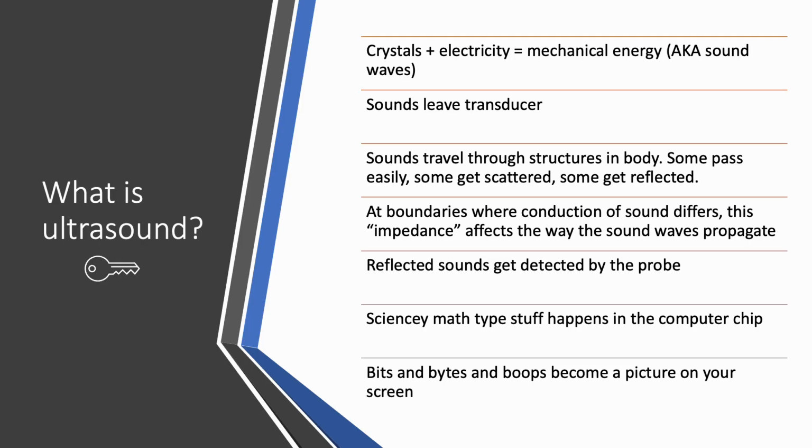So explaining ultrasound and explaining the physics behind it can get really complicated. And so if I was going to give you one key slide, and you'll notice that little key symbol there on the left, to remember, to understand what I want you to take away from this, this is that slide. In the most basic of terms, ultrasound relies on wave generation, wave propagation, wave interaction, and then wave signal reception and processing. So crystals and electricity have to come together to create mechanical energy in the form of sound waves.